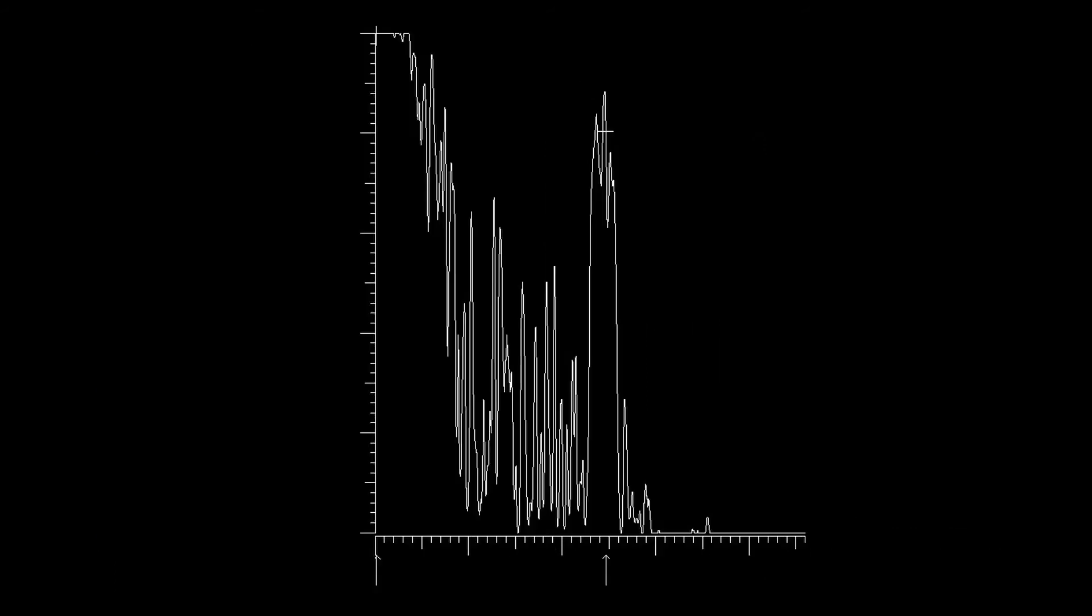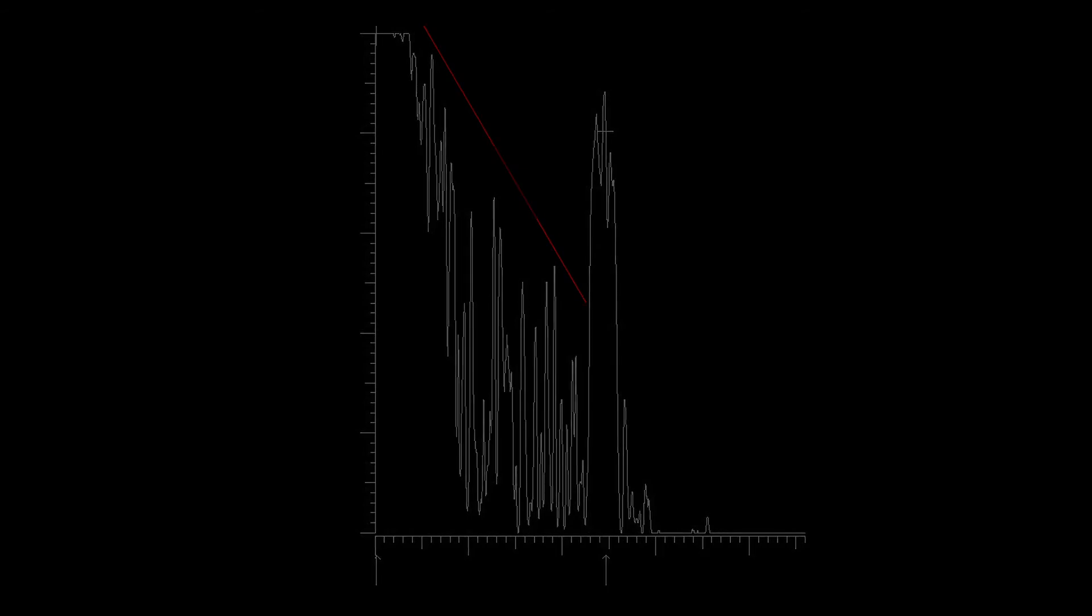Ultrasound attenuation occurs when the sound is absorbed or deflected. On A-scan, this is indicated by progressive decrease in spike height within or behind a lesion. The degree of attenuation is often described by approximating the angle at which spike height decreases from left to right, referred to as angle kappa. The steeper the angle kappa, the greater the attenuation of sound.